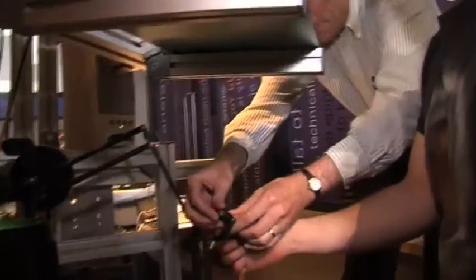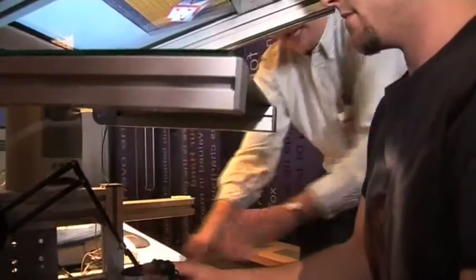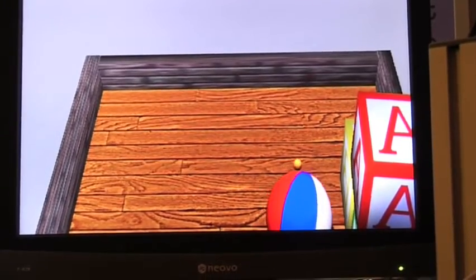William Harwin works on cybernetics at the University of Reading. How does his multi-finger haptics and hand exercise system work? In your virtual world, 2 dots. Those are your fingers. Well, they're not your fingers. Those are 2 dots. But those are going to be the representations of your fingers.